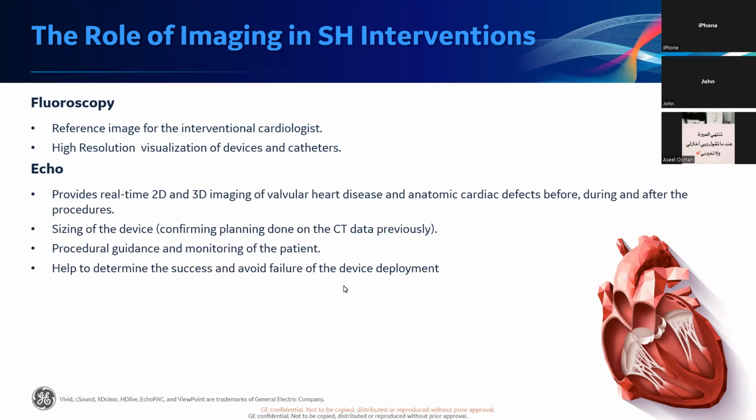In terms of imaging modalities for structural heart interventions, of course, there is the conventional, traditional, the interventional modality, which is fluoroscopy.